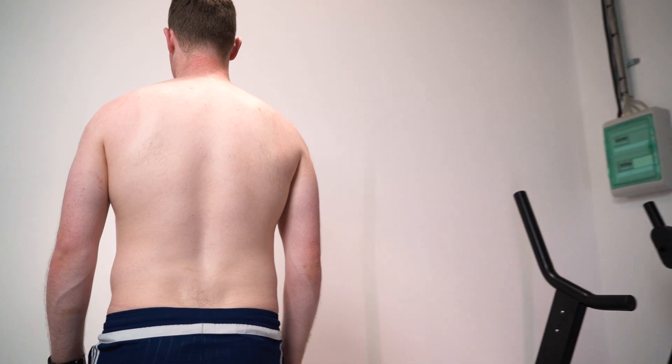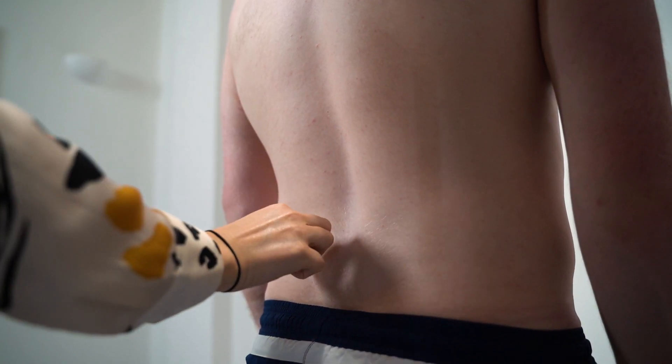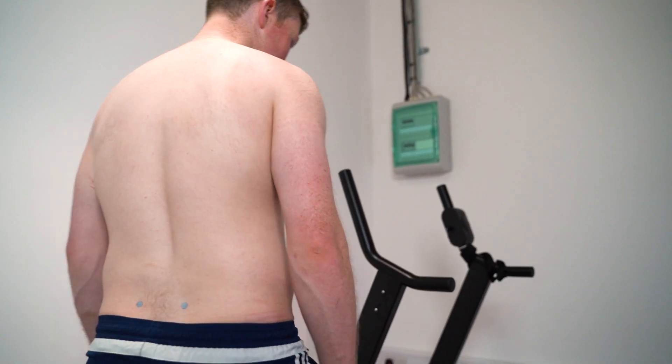FCE scan is a motion analysis scan. It is radiation and magnetism free. We scan spine, pelvis, legs and feet both statically and in motion to find the root cause of injury.